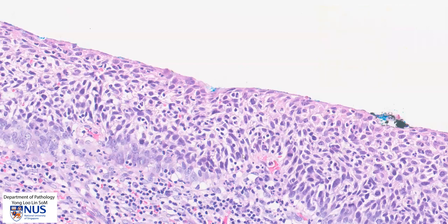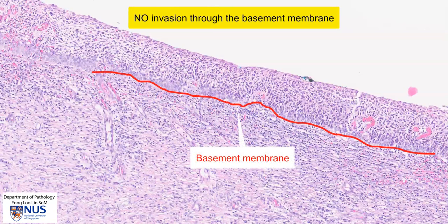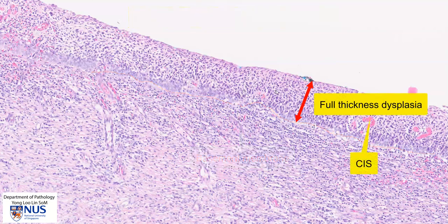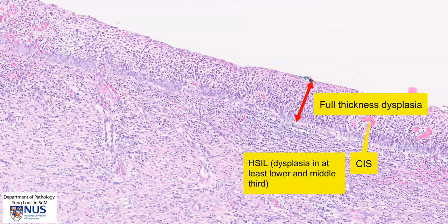So this epithelium is dysplastic or neoplastic. However, we can see that there is no invasion through the basement membrane into the stroma. Hence, this neoplastic process is still limited to the stratified squamous mucosa and is present in the full thickness of the mucosa. Hence, this is carcinoma in situ. Other names for this include high-grade dysplasia as well as high-grade squamous intraepithelial lesion, or HSIL. All these names mean there is still no invasion through the basement membrane. If there were invasion through the basement membrane into the stroma, the diagnosis would be squamous cell carcinoma.